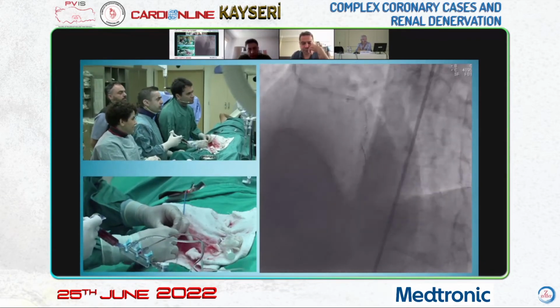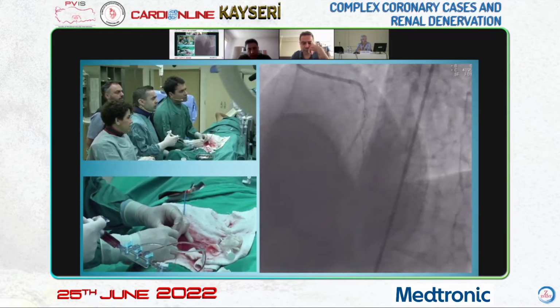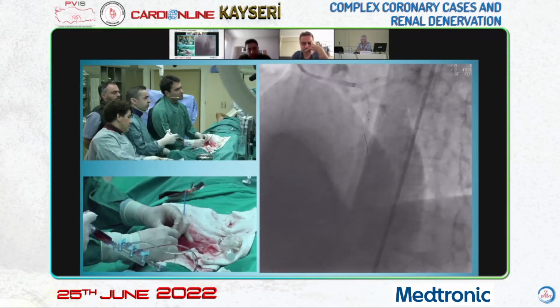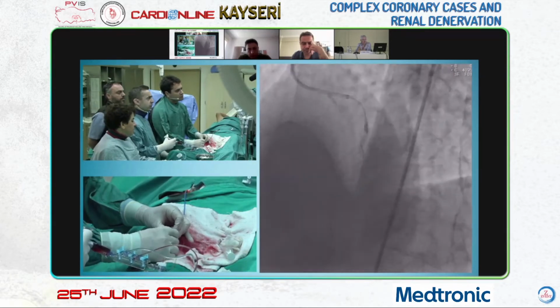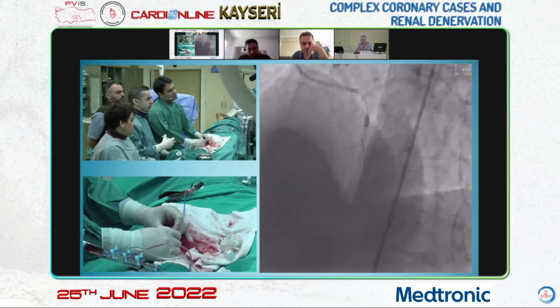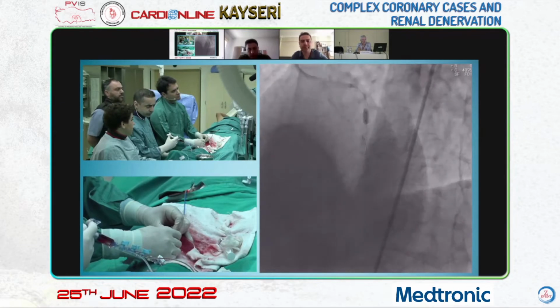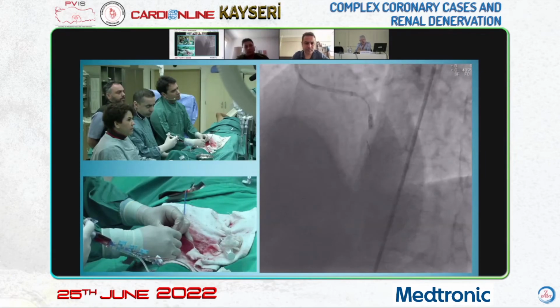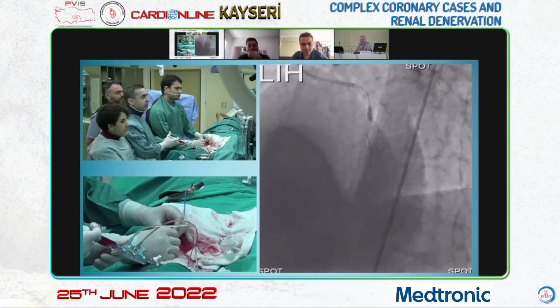We will make the pot above. We dilated the other part a bit. Six, 8, 10, 12, 14, 16, 18. Let's add a bit more. The opening is very good.